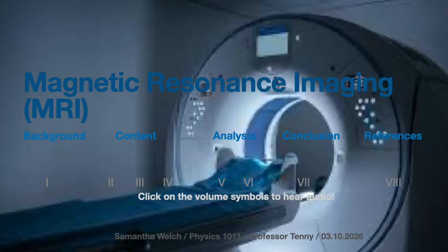Today, MRI plays a very critical role in diagnosing conditions such as brain tumors, strokes, spinal cord damage, ligament injuries, and cancer. MRI is particularly valuable because it produces extremely detailed images of the soft tissues, which are often difficult to see using other imaging technologies.